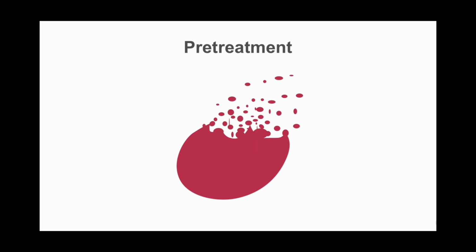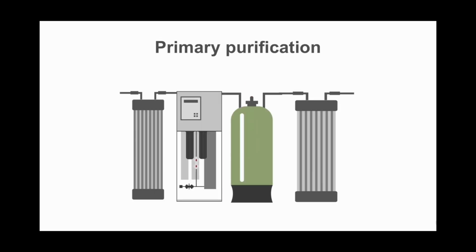So it is a side effect of chloramine present in the municipality water. That is why there are two filters in series, so that if one of them gets exhausted or wears off, the second one will help in removing the chloramine, and by that time we can add a new activated carbon. So this was pre-treatment.